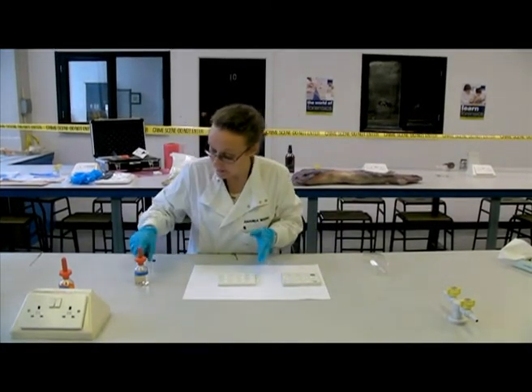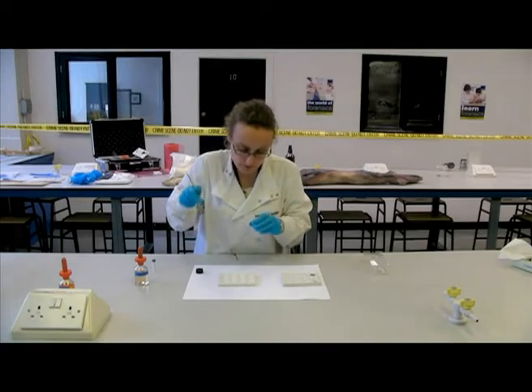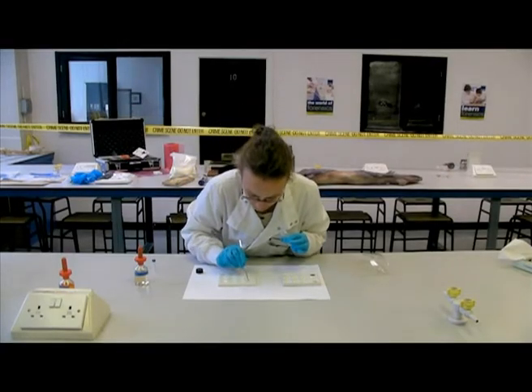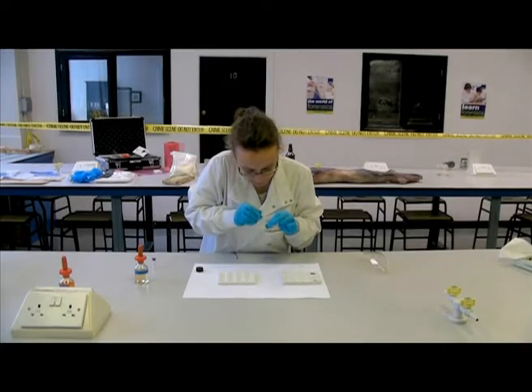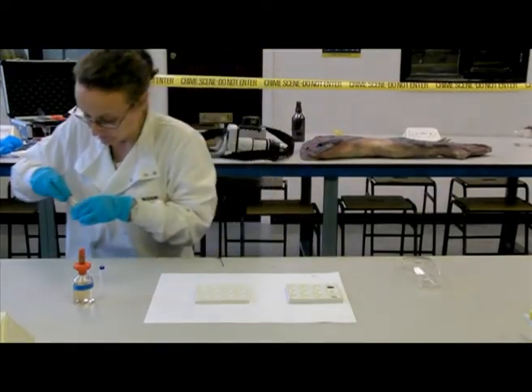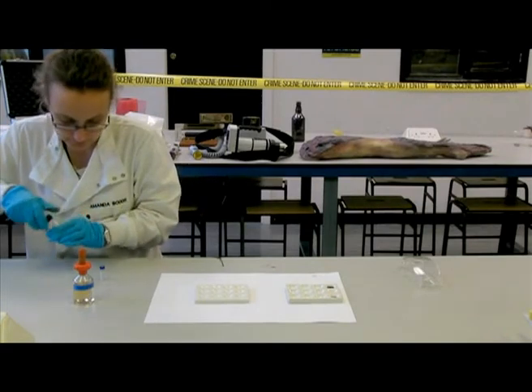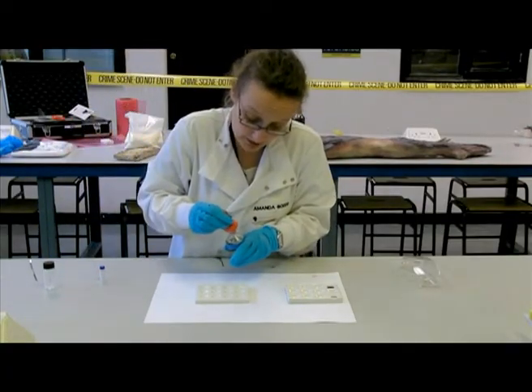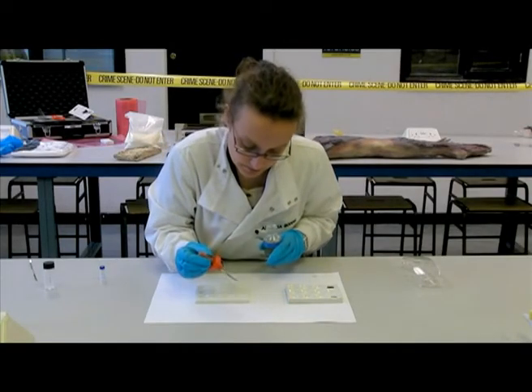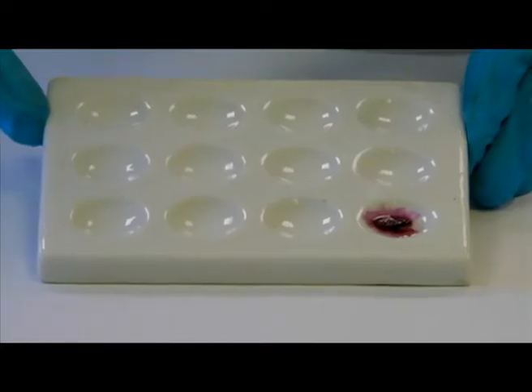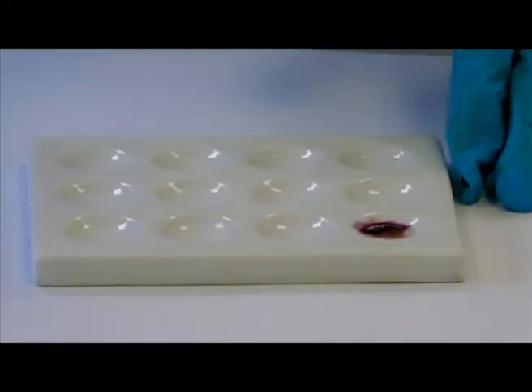So this was our test for amphetamine. Now I'm going to move on to test our street drug which we think is heroin. So again we take a small amount of our sample and put that into the well plate. And we're going to be using the marquis reagent. This nice purple color indicates to us that there is heroin present.